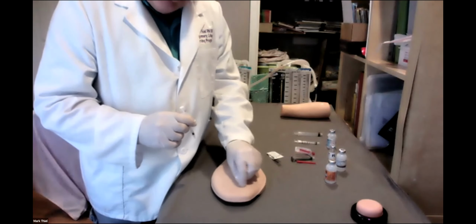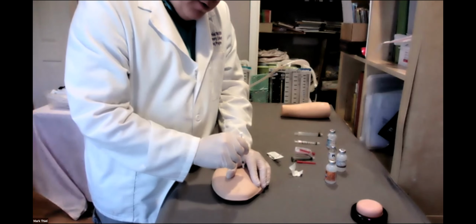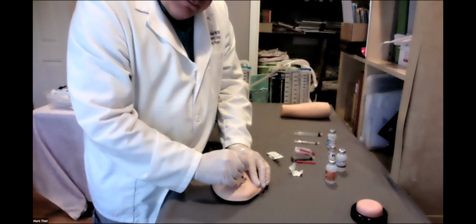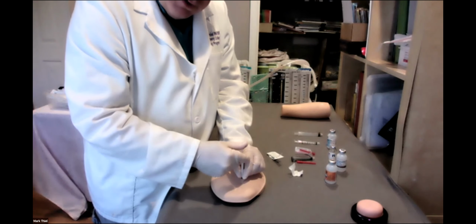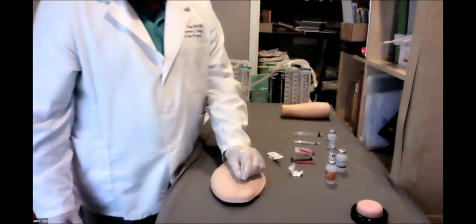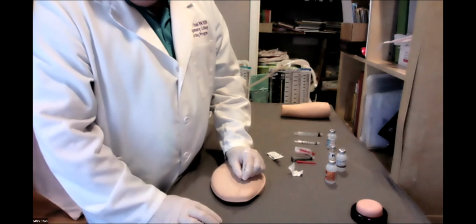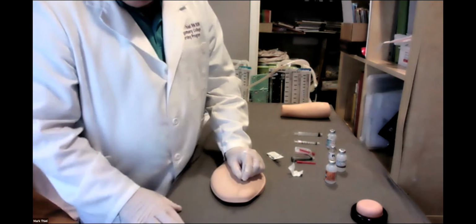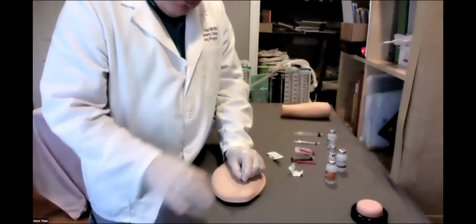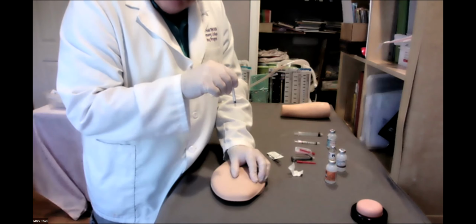Rub my site to the count of 30. This particular case, 90 degrees, and push it in and inject. Notice I'm securing it this way. What don't I do? Remember, back to the IM, no Z track. This is sub-Q. And withdraw.